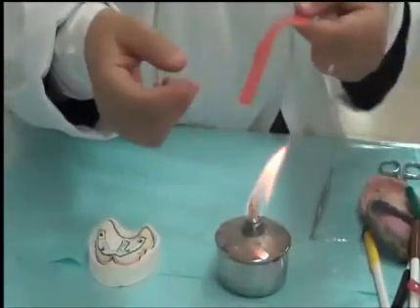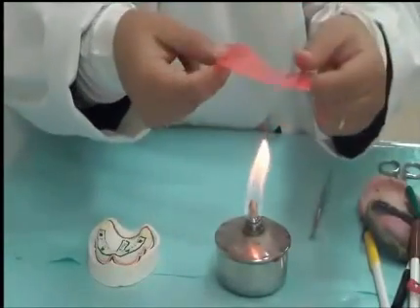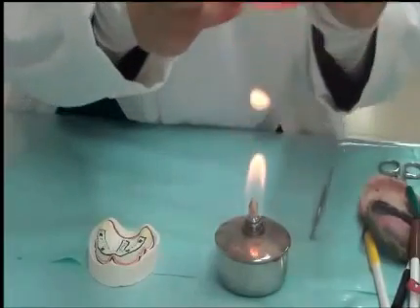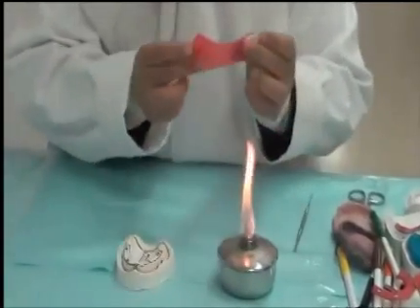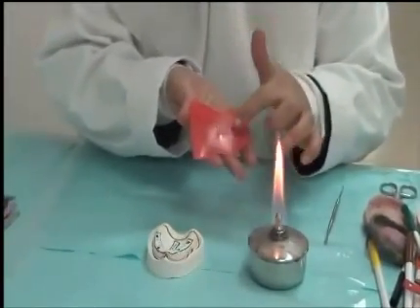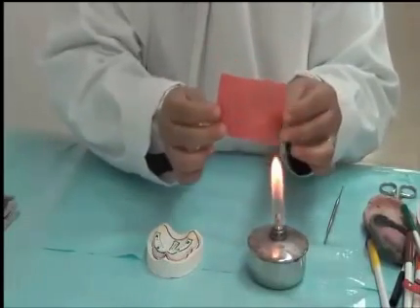We heat the piece of base plate wax until it is soft enough that it doesn't hold its weight. You can see that it's flowing, and I'm also heating it from multiple sides. This is called tempering, which is slowly heating the material. I don't allow the surface to drip. It becomes a bit light in color and pinky.